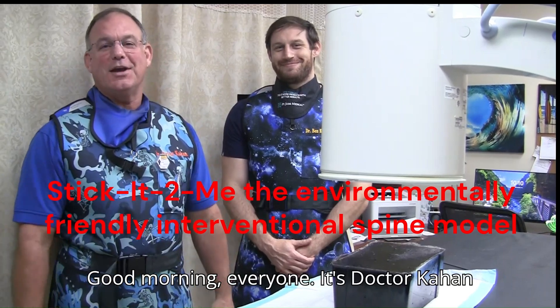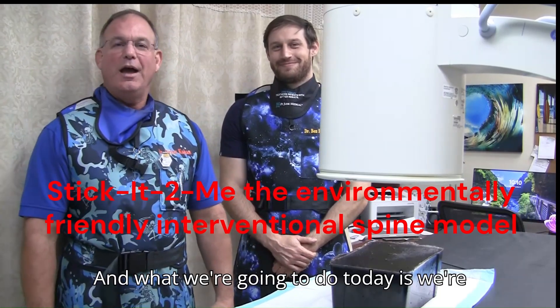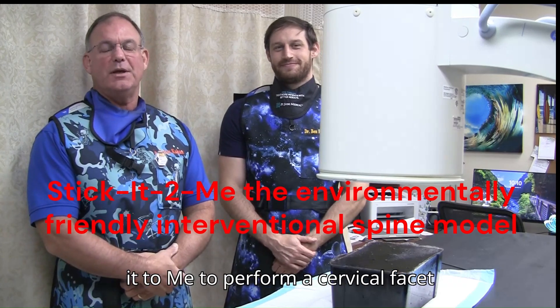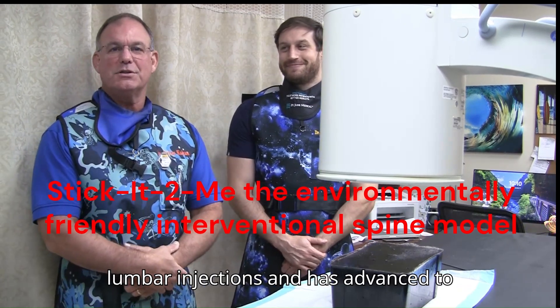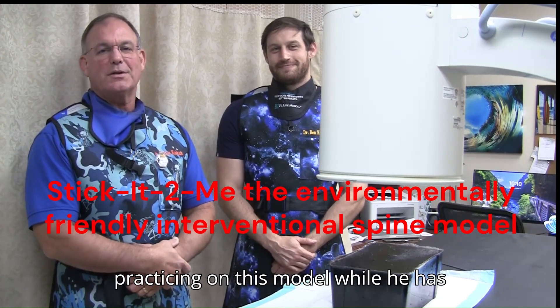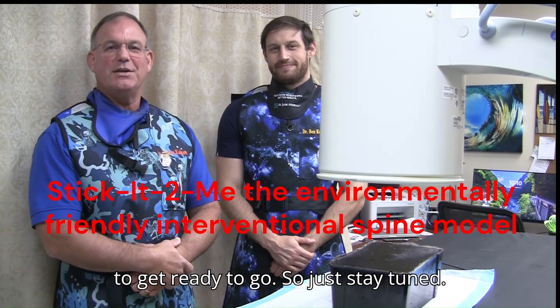Good morning everyone, it's Dr. Kahan here with Dr. Kestenbaum, our fellow that started in July at the Kahan Center. What we're going to do today is demonstrate how we utilize Stick-It-To-Me to perform a cervical facet injection. Dr. Kestenbaum has been doing lumbar injections and has advanced to cervical injections in four months by practicing on this model while he has free time in the office. So we're going to get ready to go, just stay tuned.